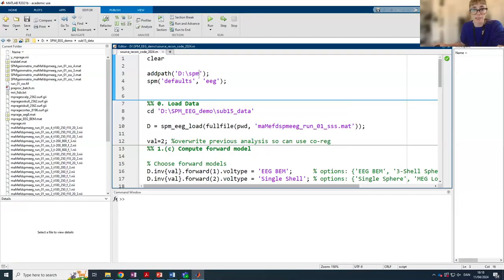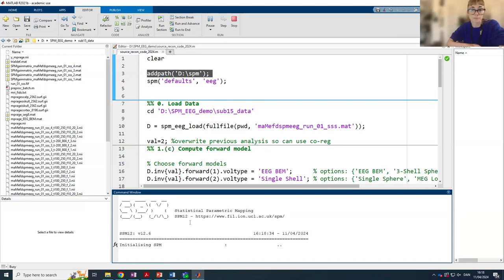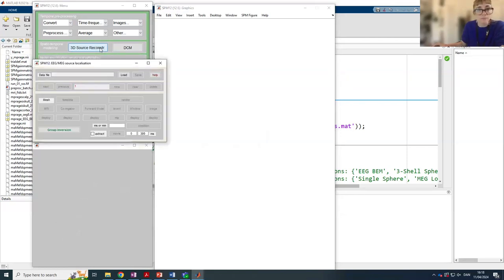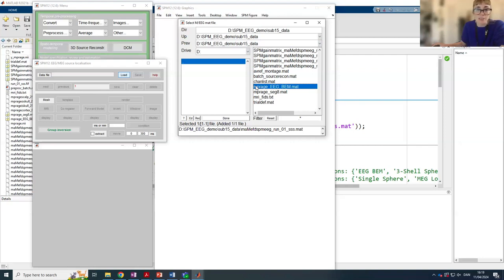Let's start by looking at the graphical user interface. First we need to add SPM to our MATLAB path, and we can open the GUI by writing 'spm eeg' in the command window. Our main window is in the upper left-hand corner, and the button we're interested in for this analysis is the 3D source reconstruction button. We want to load our dataset — here we're using data from a single subject, subject number 15. This data has been pre-processed and averaged, so we'll be performing an evoked analysis, though you can also load single-trial data for an induced analysis.